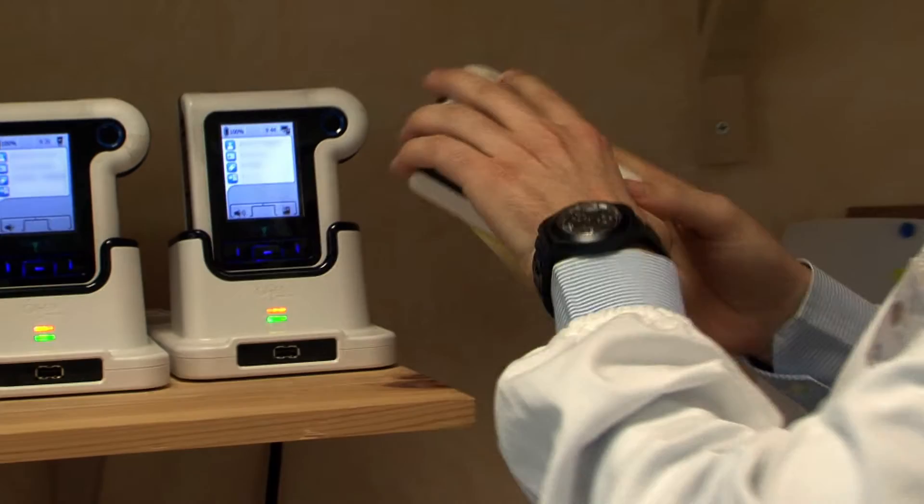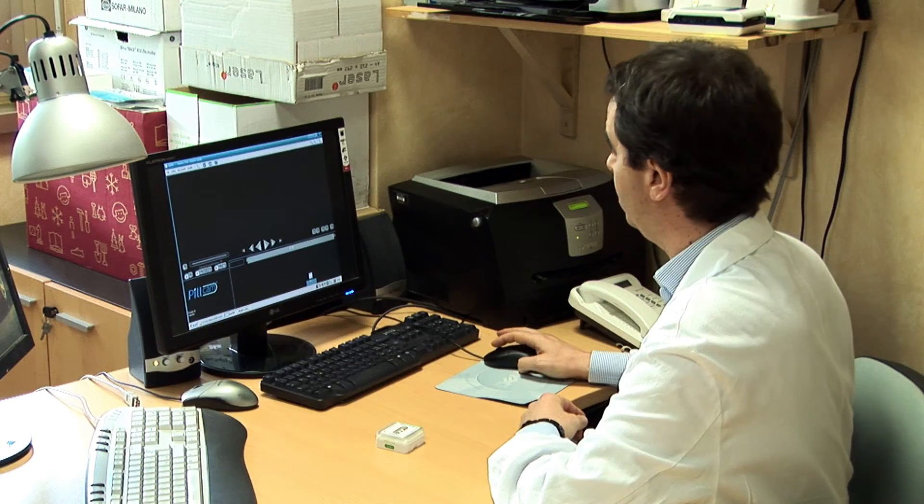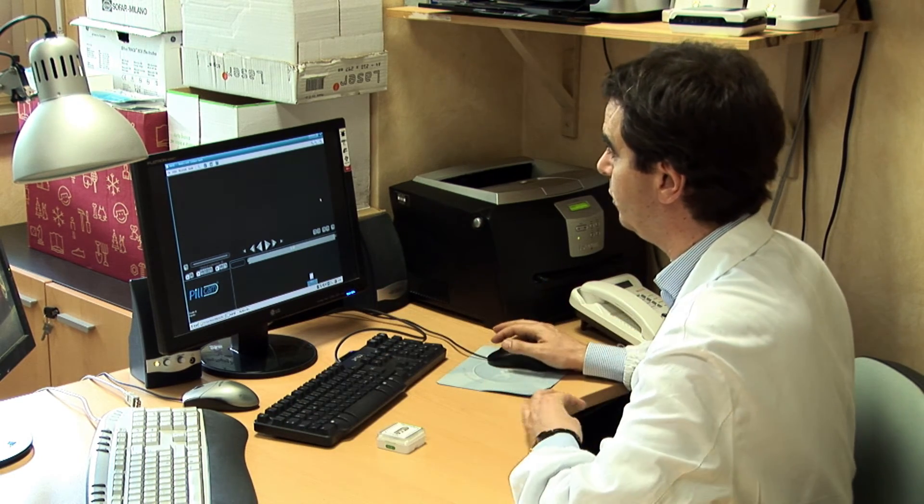It means that we have a complete colonoscopy. We invite the patient to bring back the data recorder, and we download the data recorder into the workstation and then review the video of the patient.